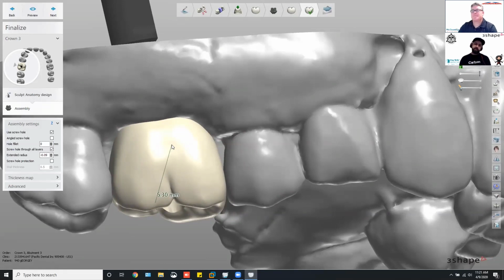Maybe a morph tool is better than a wax sculpt tool, because in one click you move a mass instead of just adding a little bit and adding up, and that affects rebuild time and the size of the case. So yeah, for sure.